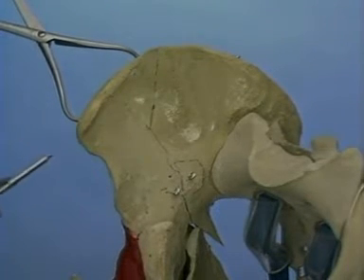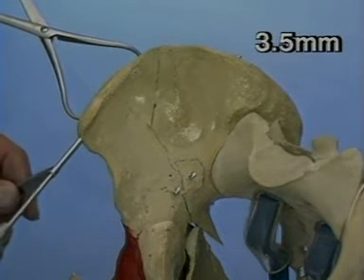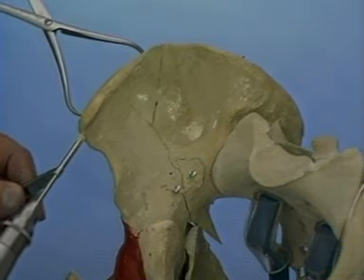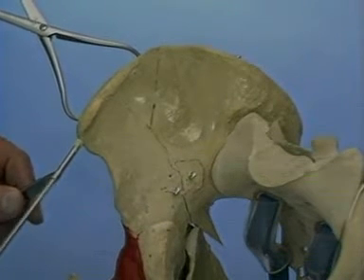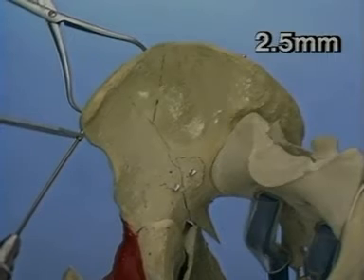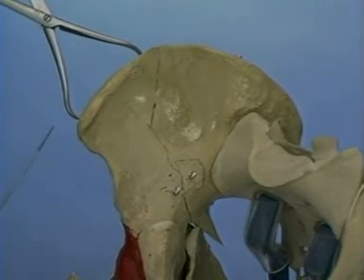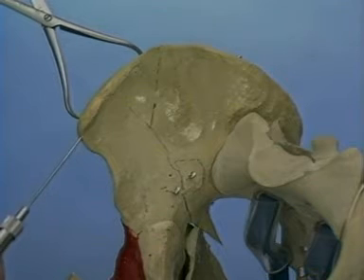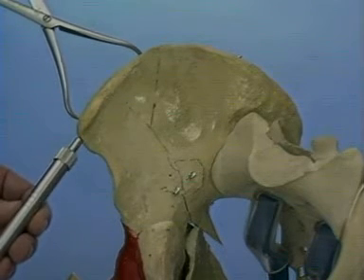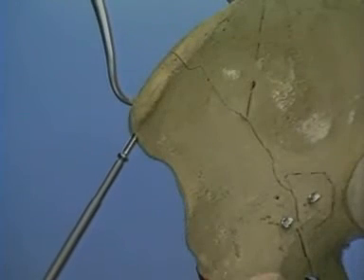Another 3.5 millimeter lag screw is inserted parallel to the iliac crest. Start for a gliding hole at the anterior superior spine with the 3.5 millimeter drill bit. The 2.5 millimeter drill bit completes the hole. The depth is measured and the screw inserted.